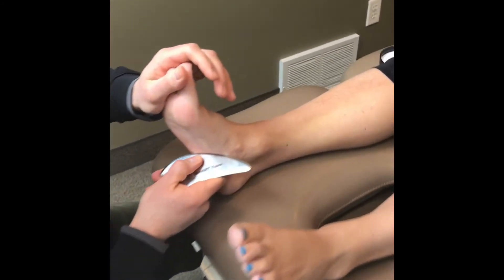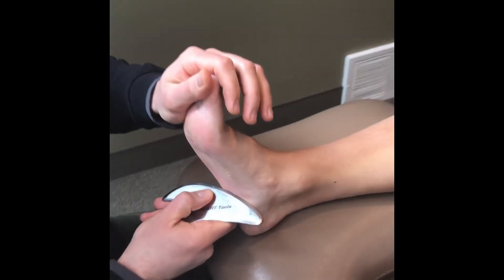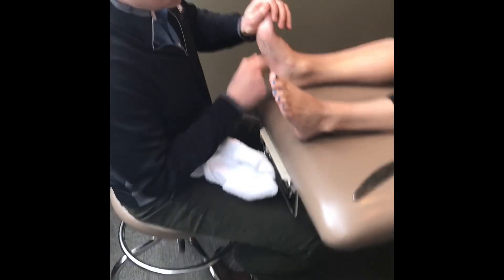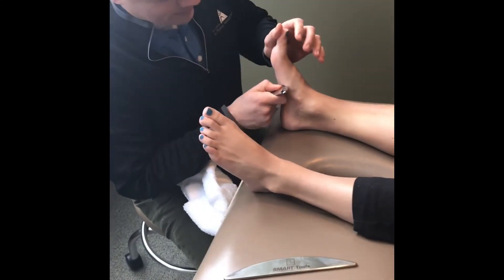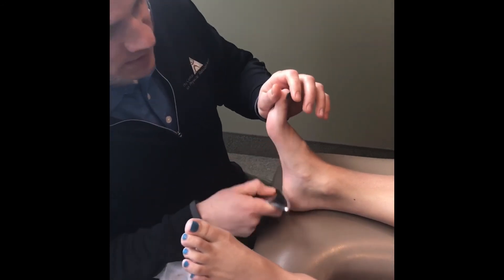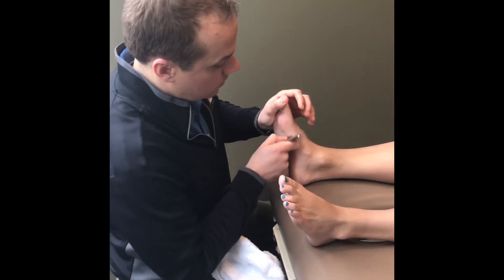Whether we're treating plantar fasciitis, Achilles tendonitis, or gastroc contracture, smart tools or instrument-assisted soft tissue mobilization provides a different feedback to your hands that is sometimes hard to pick up with manual therapy alone.